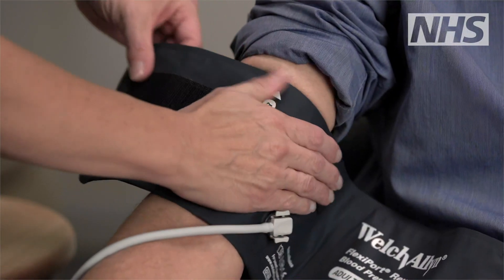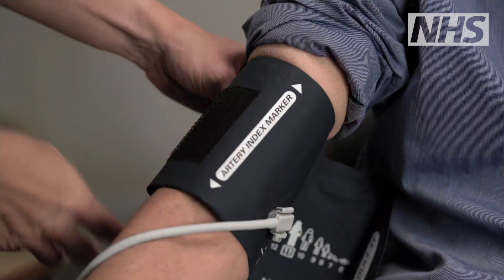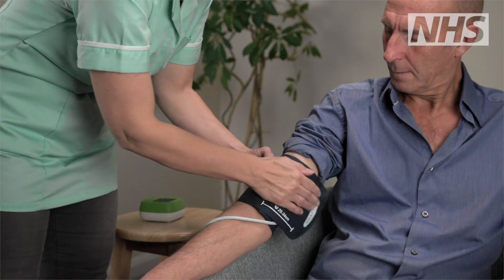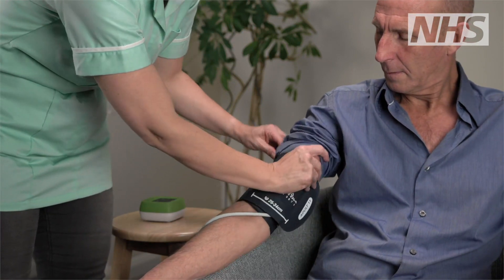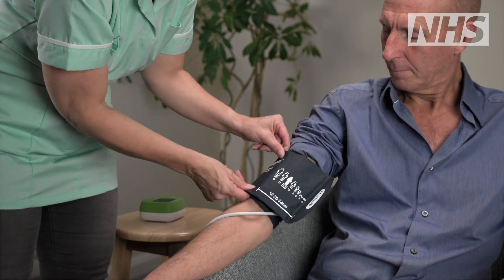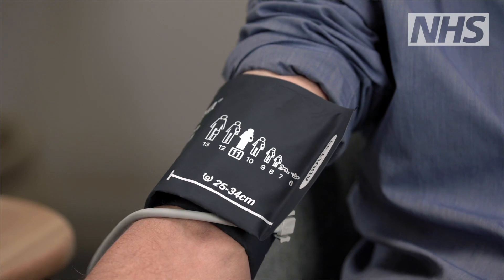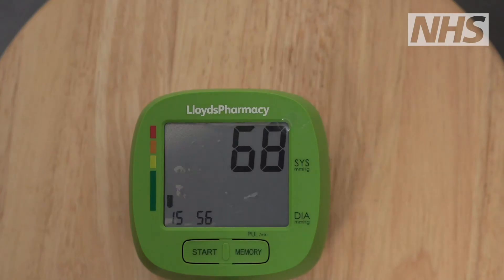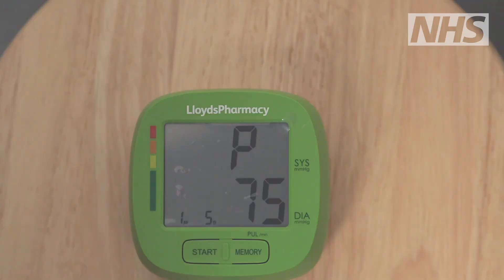Keep a note of which cuff size you use for which person. Line up the arrow on the cuff marker with the centre of their arm. Warn the patient that the cuff is going to become tight on their arm. Press a button to start filling the cuff with air, then wait for all the air to come out of the cuff. The BP will appear on the monitor — record this reading in their notes.